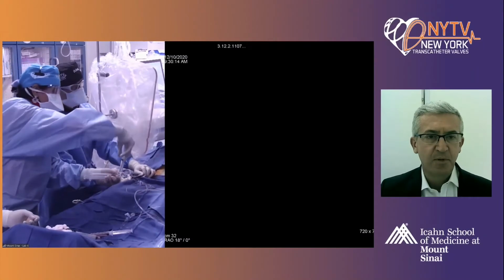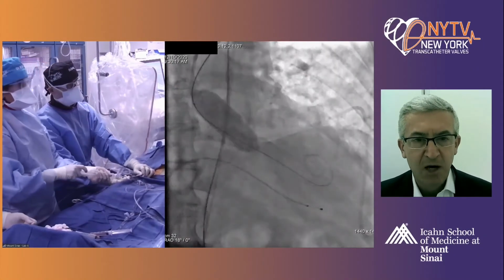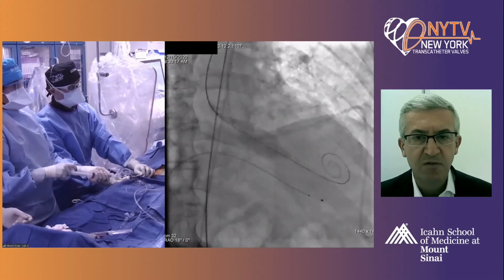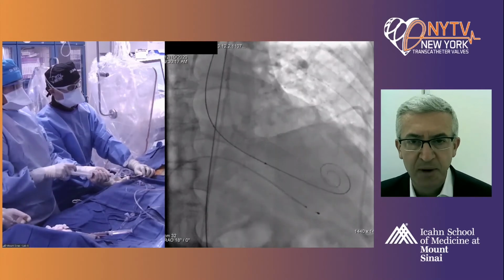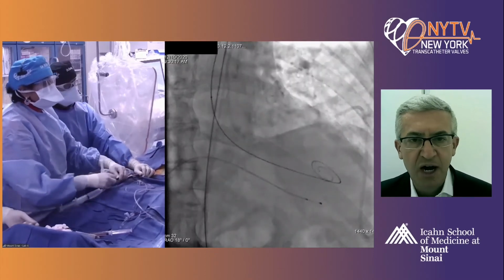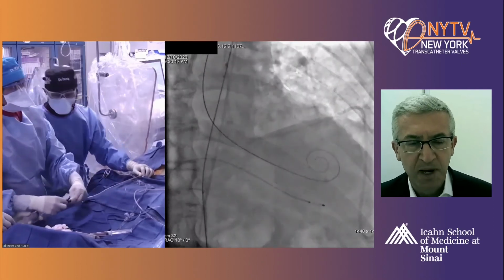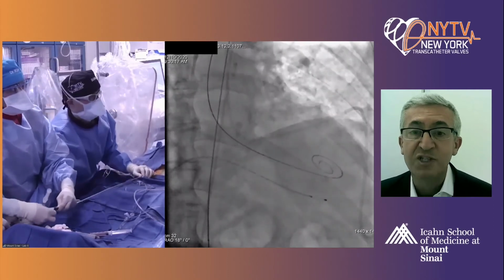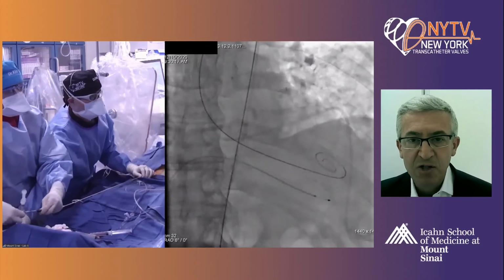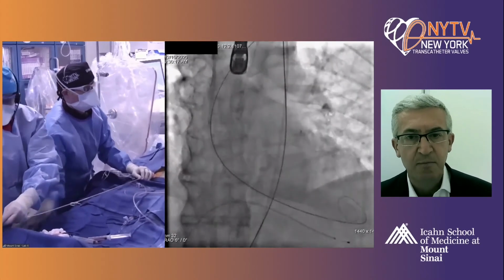I think it's an important comment, Roxana, because for bicuspid, very calcified valves, I tend to pre-dilate to prepare the valve most of the time. So I think that Dr. Sharma has the same thoughts as I did. So I would prepare, and sometimes I even use it for sizing. Remember, for bicuspid, we are never so precise in sizing. So I like to pre-dilate.